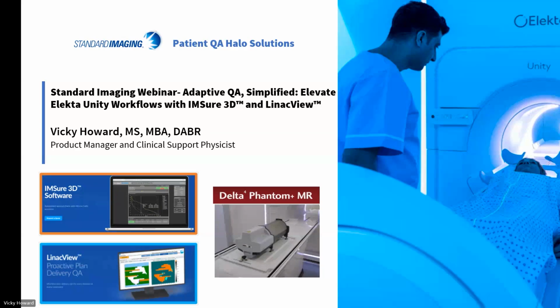So what you want to do is make sure that you are getting very reliable data for your small fields. So make sure you're using the proper detector and your field size is set accurately. But there are ways we can model. Unfortunately, that's out of my scope and area of expertise on a day-to-day basis. But we do have an in-house person who specifically does all of our beam modeling. So she's a great resource, and she knows how your system fits with all the others that she sees. So it's wonderful to have that perspective that expands beyond your own clinic.